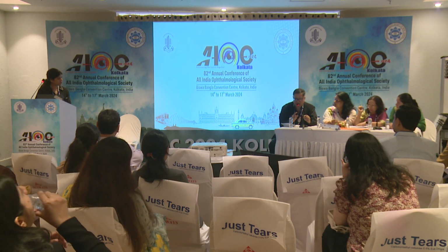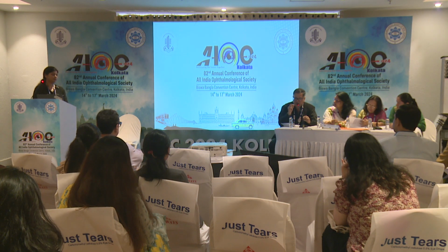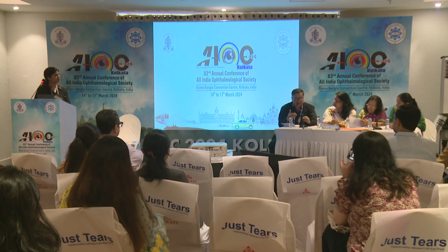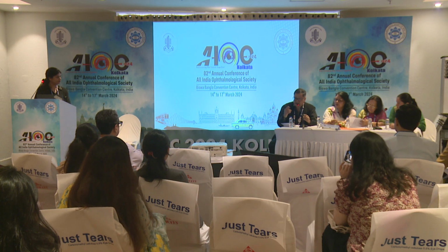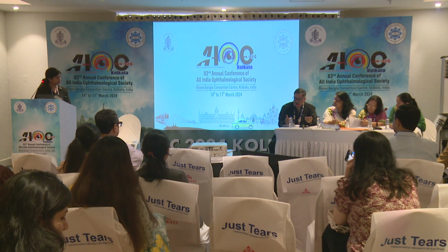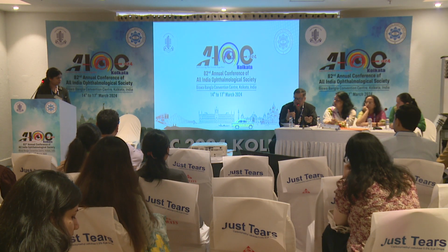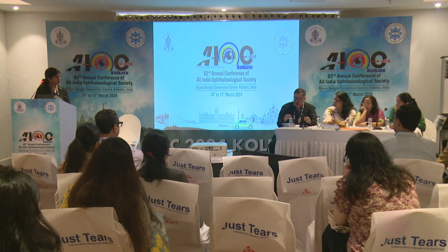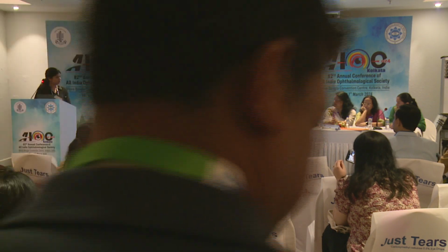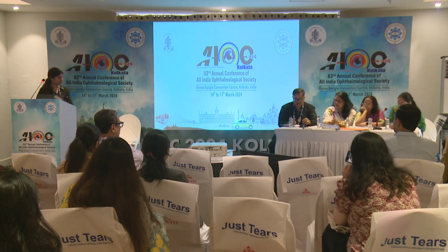You cannot make only a standardized incision for all grades of astigmatism. The longer the incision, the more the flattening, is it not? The more anterior the incision, the more the flattening. These certain rules are there. So have you gone for that? So far we have not done that, sir, but yes, sir, it should be taken into consideration. Okay.